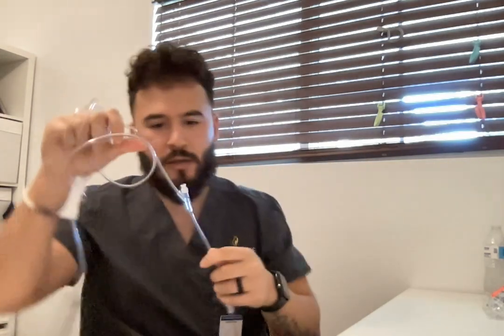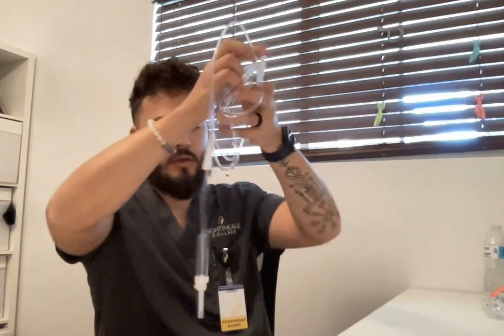Then we have our Y port, which is right here. This is where we're going to connect the medication line. Before we connect it, we're going to clean it with the alcohol pad. We'll get into that later. And then we have our adapter. This is going to go into the patient's IV. So I'll leave this here.